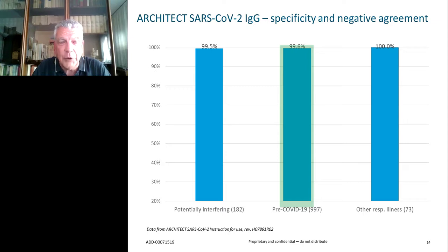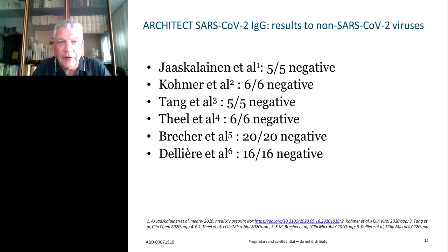But even in this case, we do have external evidence. First of all, in the validation process, we were not able to assess the eventual cross-reactivity to other coronaviruses because those samples are quite rare and were not available for the internal validation. But as of now, we already have 6 different external and independent evidences that check this, and all of those confirm that this assay does not react with samples from other coronaviruses. So all those, almost 60 samples, come up negative.